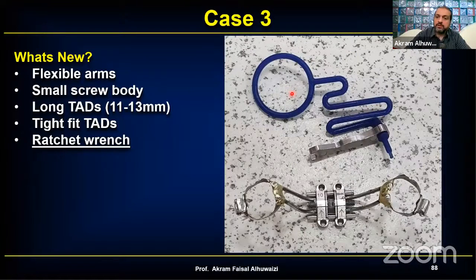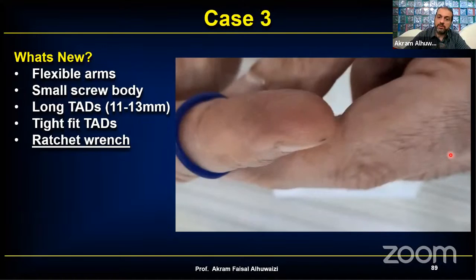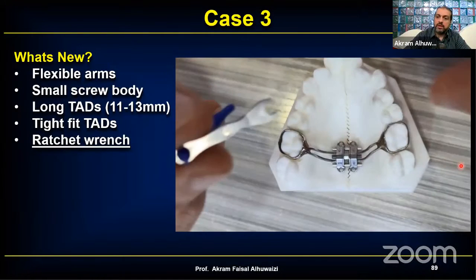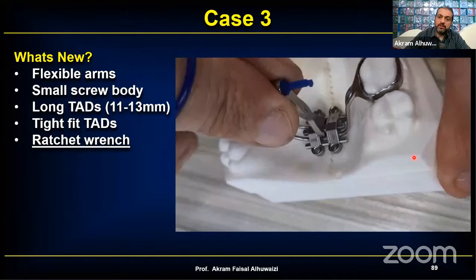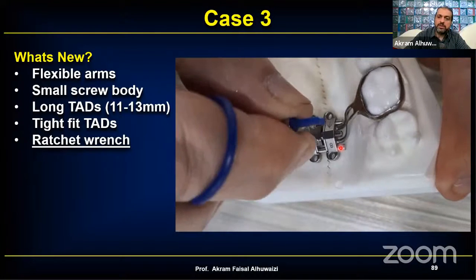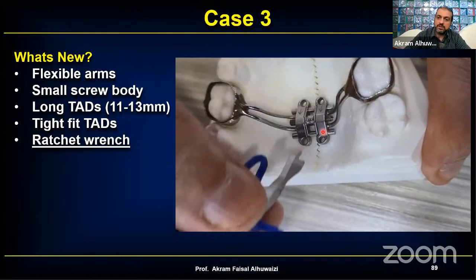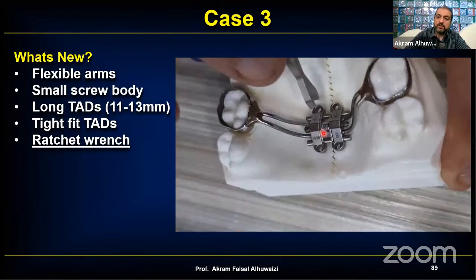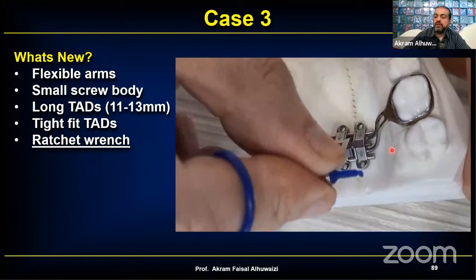So you would usually get the ratchet itself, this one, and you would get a finger locking device like this. And this is essential to use because if you don't use this, then the patient may swallow it. So you'll have to put it on your finger and then insert this more mesially and just push it back all the way till it hits this bar. So it's quite simple, but since it's only 1/6, many times you'll need to do it twice. Sometimes you only need to do it once, but you just teach the patient that way, and it's fairly easy to use, provided it doesn't slip.